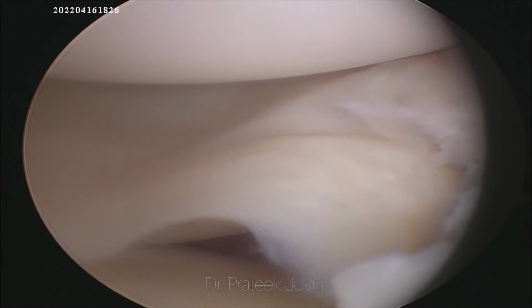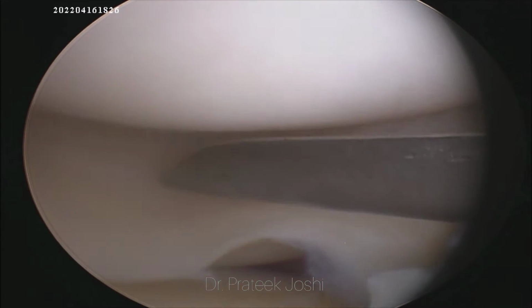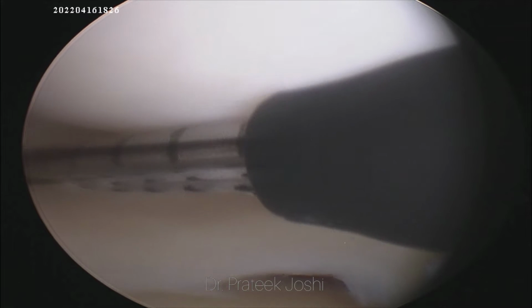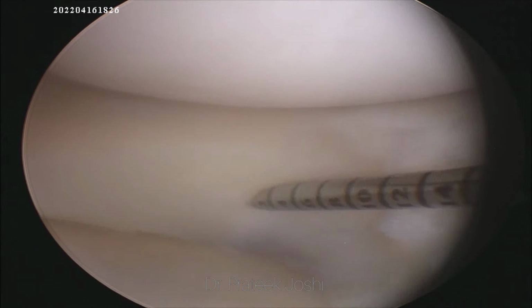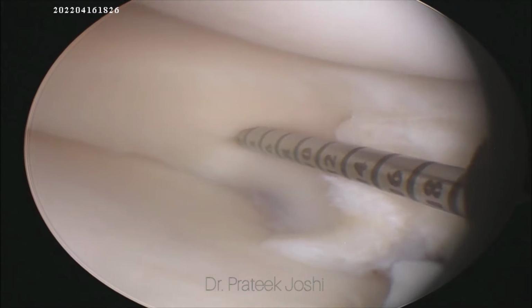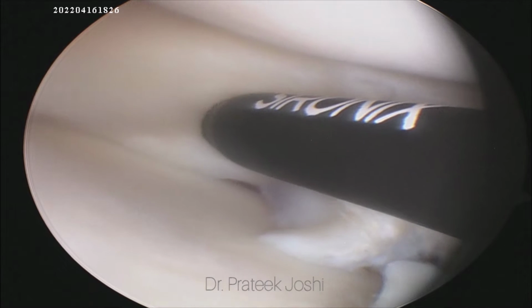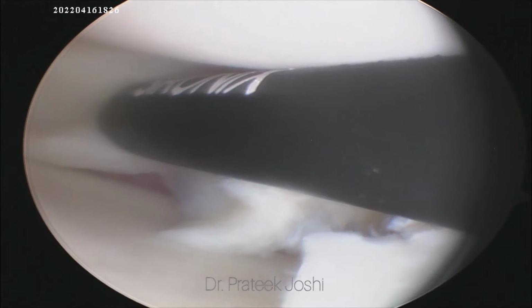So now before we start the meniscus repair procedure, we are going to do MCL pie crusting to have better access of the posterior horn of the medial meniscus. And now we have inserted the all inside device, and we are going to take our first bite through the posterior part of the medial meniscus. This is going to be a vertical mattress configuration suture repair.